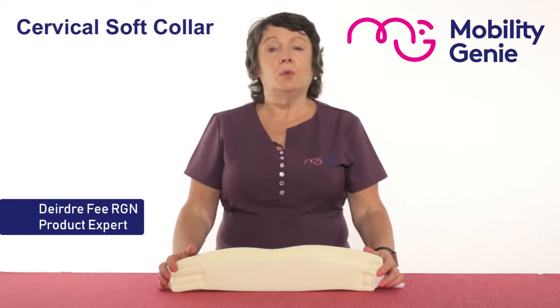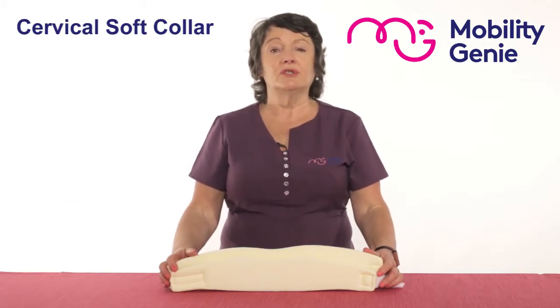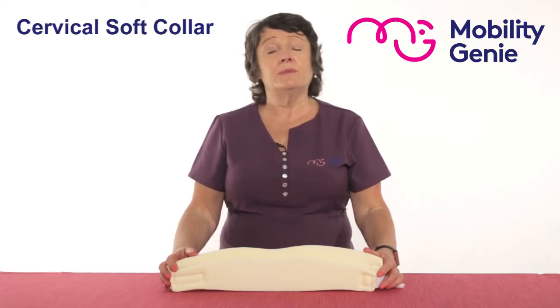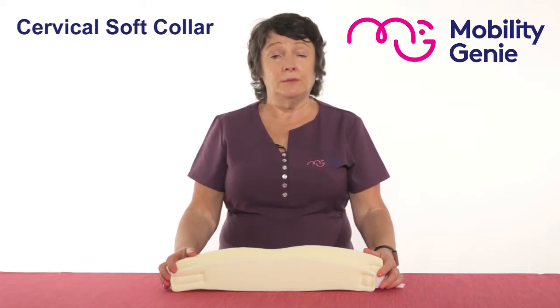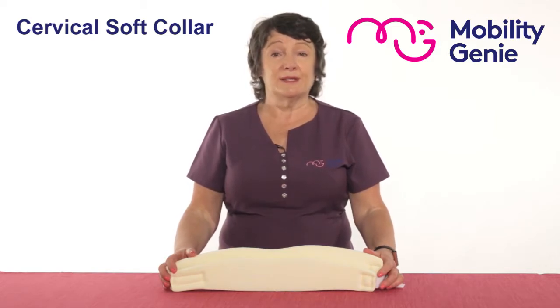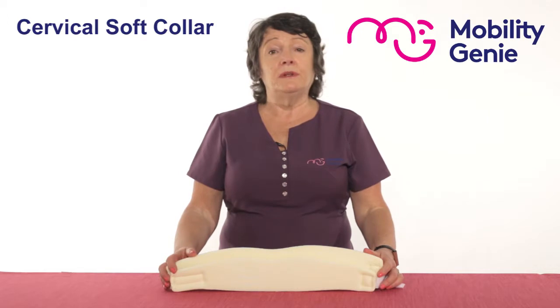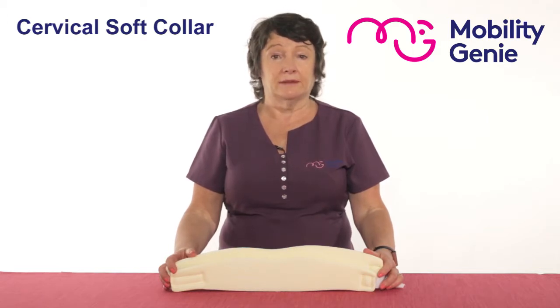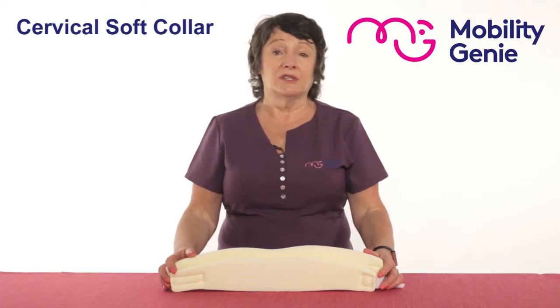At Mobility Genie we recommend the Vulcan range of cervical soft collar. These would be generally recommended by your physio, your physical therapist, your GP or a medical consultant, and it would be for the purpose of taking the weight of the head off the shoulders, thus giving pressure relief to the neck and the cervical discs. This would be usually after a neck injury.